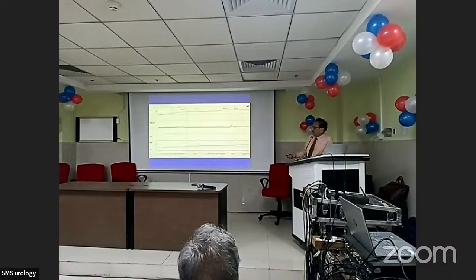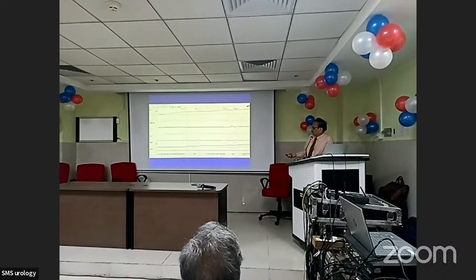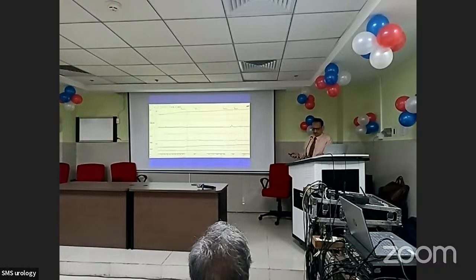Detrusor overactivity. This is the pressure and the overactivity. This is the overactivity, and this is the continuous. So that's what it is.